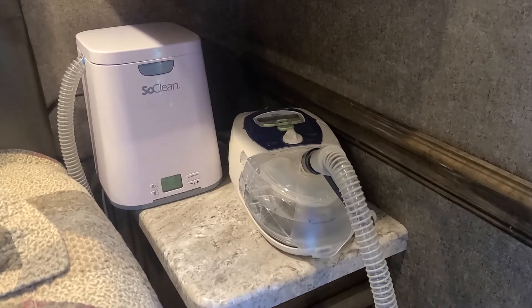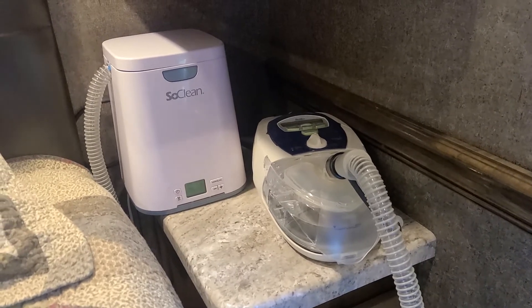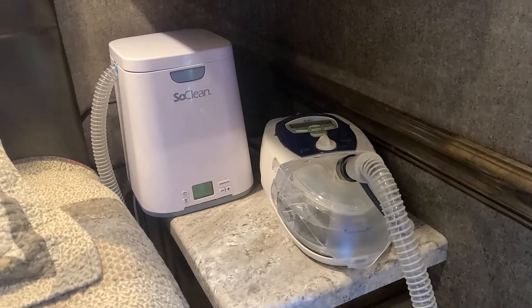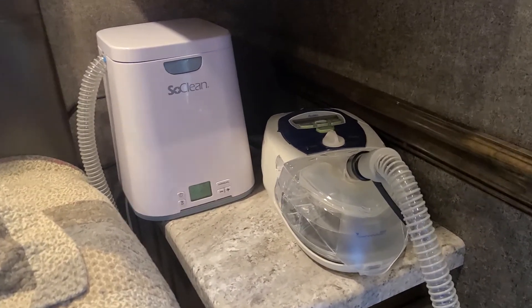Hello, I have the SoClean CPAP unit cleaner. It's a great unit. I've had it for a few years now and it does a great job cleaning the CPAP mask and hose and the tank on the CPAP unit itself.